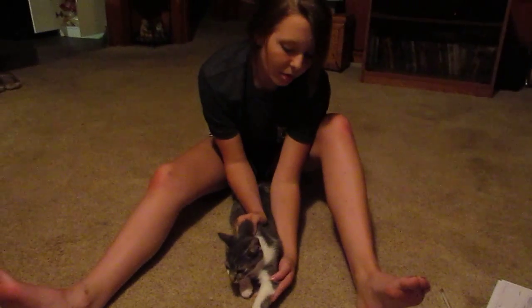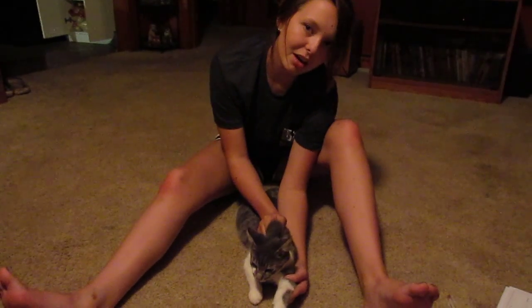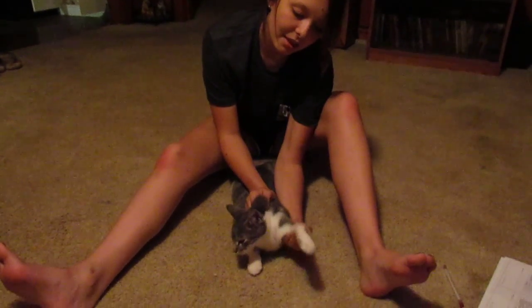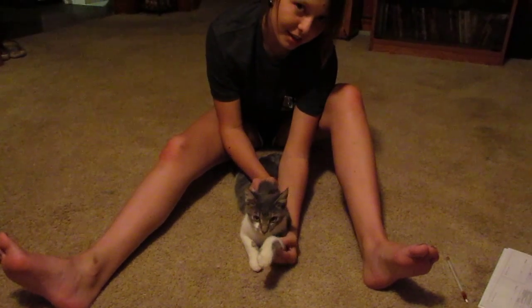You move your thumb laterally in order to expose the vein, and then your veterinarian or whoever would take the end of the paw and extend it. That's it.